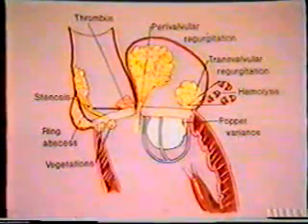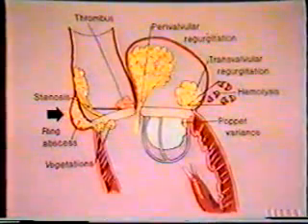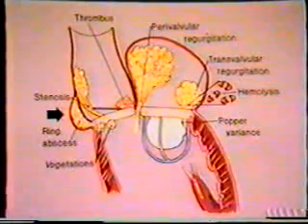Infective endocarditis can lead to valve ring abscess, a complication which will be discussed subsequently, along with other abnormalities of the valve bed.